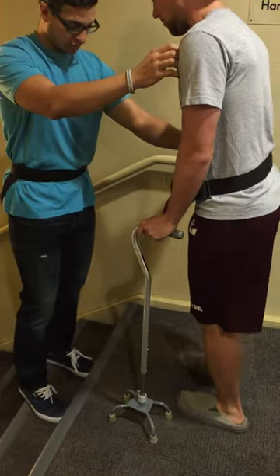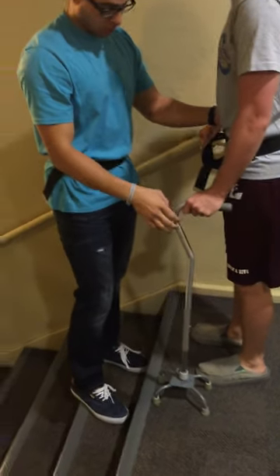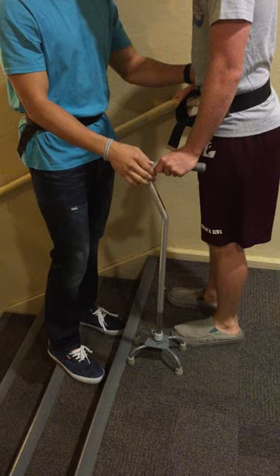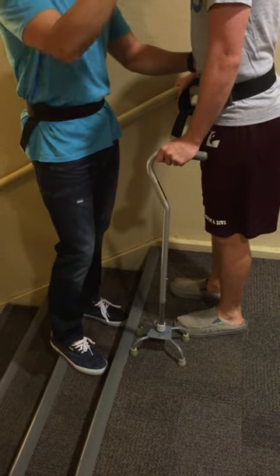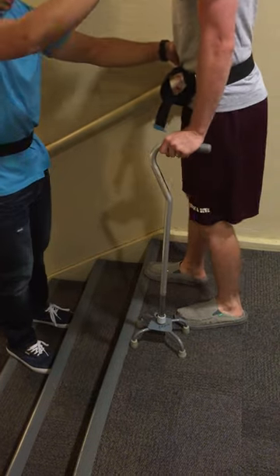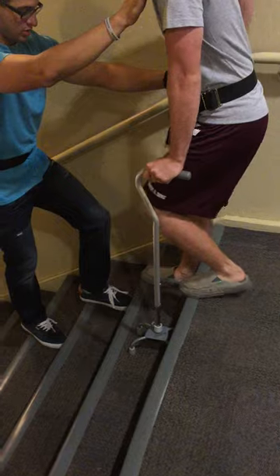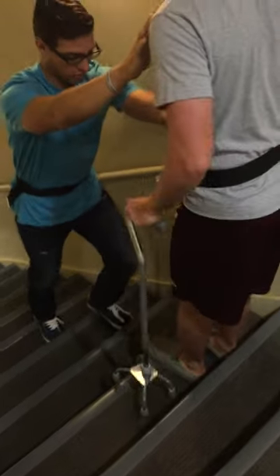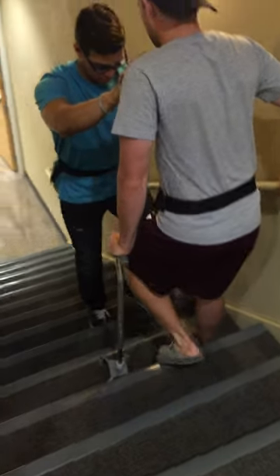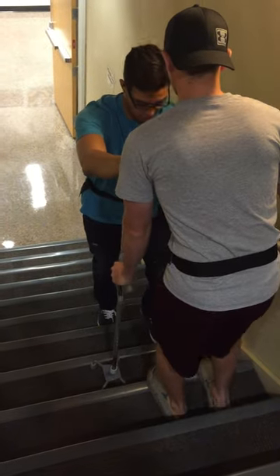Now what we're going to do is go up and down stairs with the cane. We're going to move in with the right hand first, then the left. We're going to go left leg, right leg, and then bring the cane to follow. And when you bring the cane on the stairs, just turn it inward like this so it'll fit. How does that feel? Good.